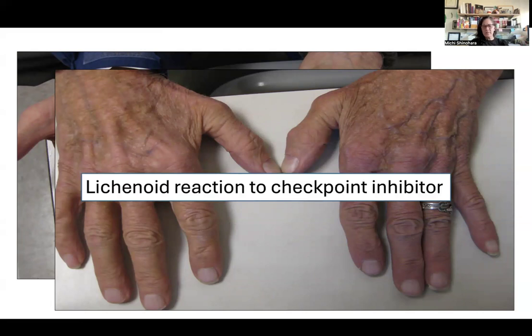So if we didn't know that this was a rash, we might call it a single lesion, benign lichenoid keratosis, for example. But with the clinical history, we can come to a better diagnosis. So that sums up just a quick whirlwind introduction to dermpath, structures, terms, and the importance of clinical pathologic correlation.